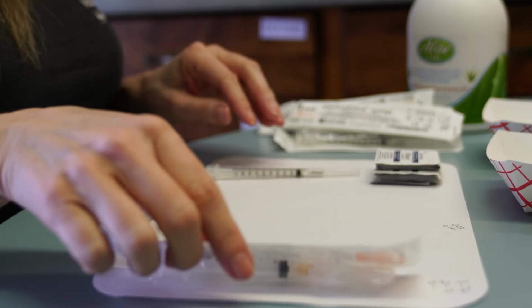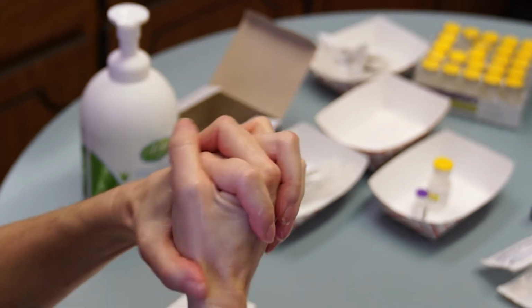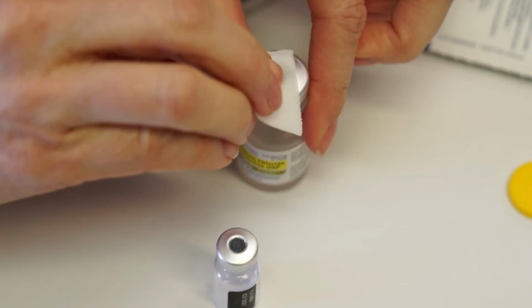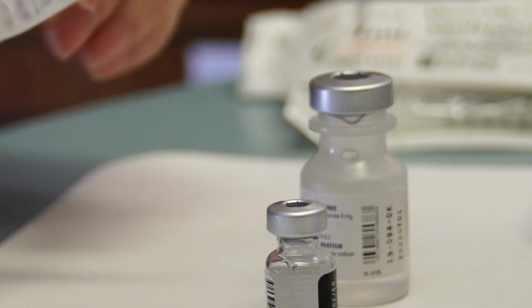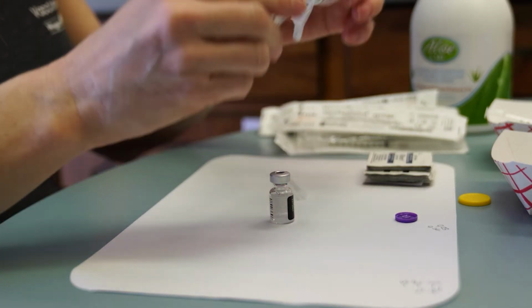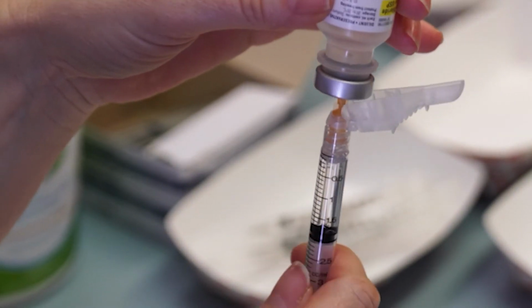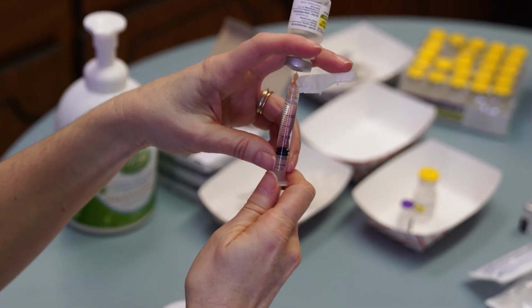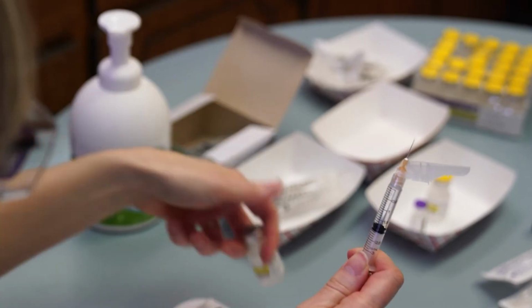After preparing your workstation according to infection prevention and control principles, and ensuring your hands have been cleaned with alcohol-based hand rub according to policy, open an alcohol swab and clean the top of the 0.9% normal saline diluent. Allow the alcohol to dry before piercing the stopper with your 3 mL syringe. Once you enter the vial of normal saline, carefully and slowly invert the vial and withdraw exactly 1.8 mL. You must exercise caution when doing this as there is suction in this vial. Be sure to hold your plunger as you withdraw the needle from the rubber stopper to ensure that you don't lose any of the 1.8 mL volume.